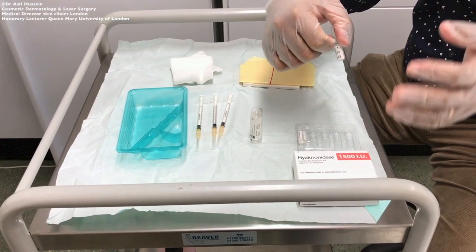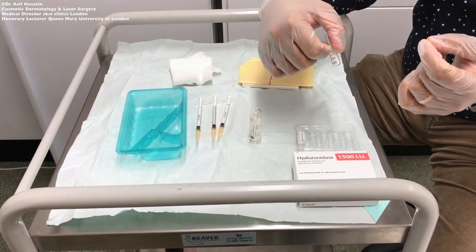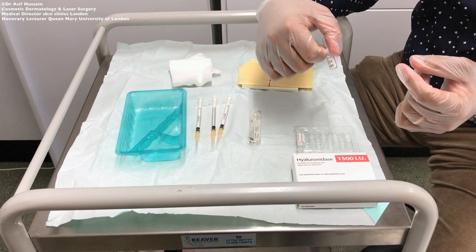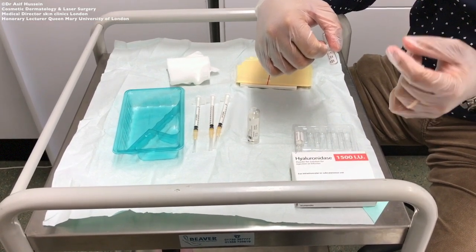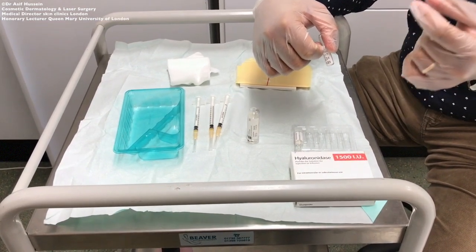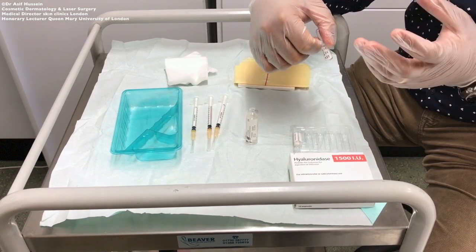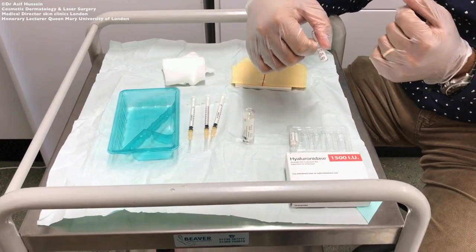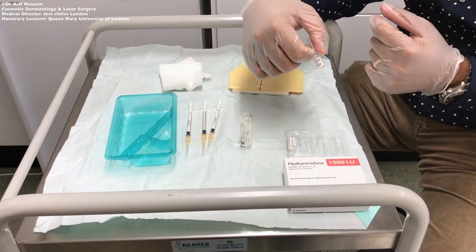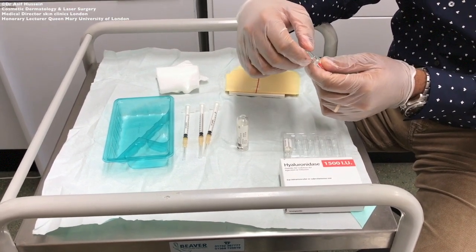What we will do now is prepare three different concentrations of hyaluronidase. In my practice, if correcting a small excess of filler, I would normally use a concentration of 150 units per ml and small boluses of that concentration — such as 15 to 30 units — to remove small amounts of filler. On average, I would use 15 to 30 units of hyaluronidase to dissolve 0.1 ml of hyaluronic acid filler, and a concentration of 150 units per ml would suffice for small corrections.